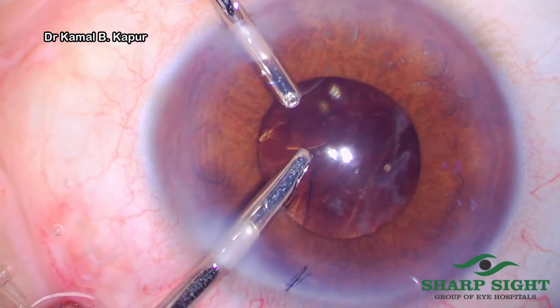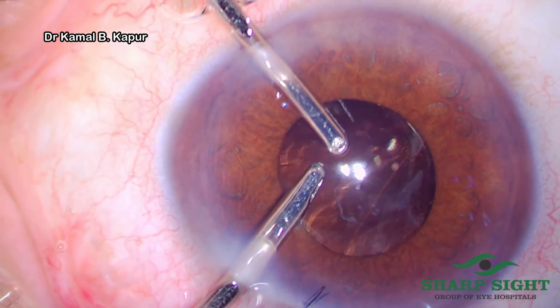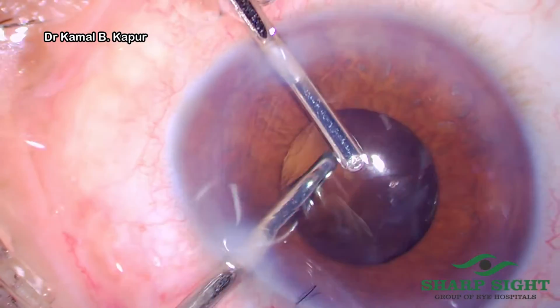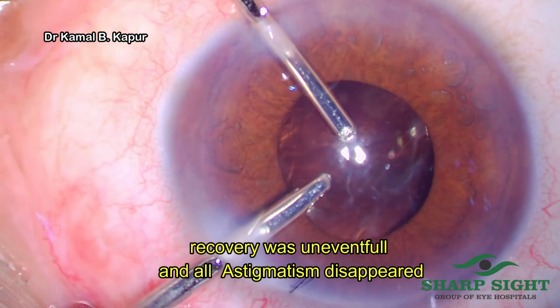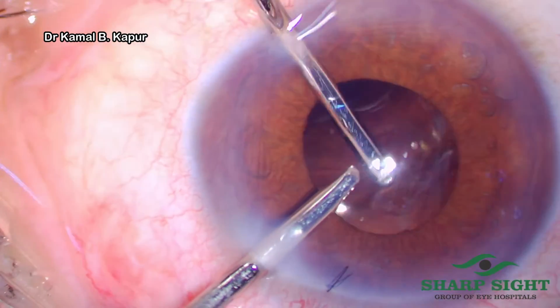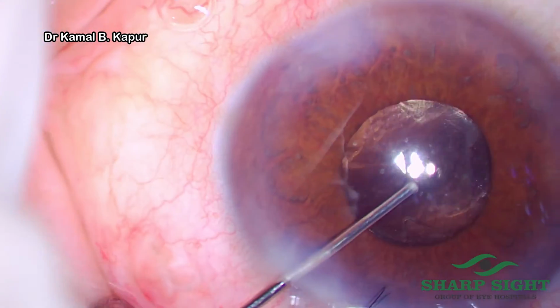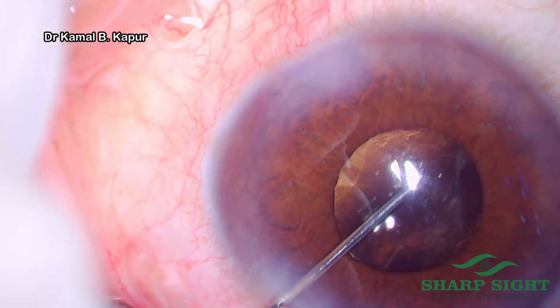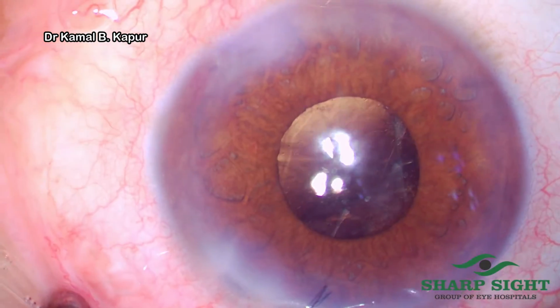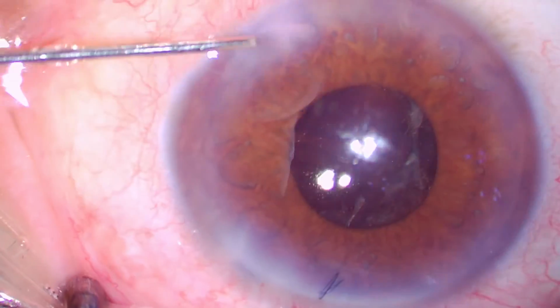Now in this situation, with a very large capsular bag, if we had a large wound or 2.8 wound, a constant shallowing of this wound would have probably resulted in the lens continuing to vault into the anterior chamber and maybe decenter again. So having worked through side ports only has made sure that we have a stable wound, a centered lens and a round pupil. Now this patient post-operative had all the cylinder astigmatism which had disappeared.